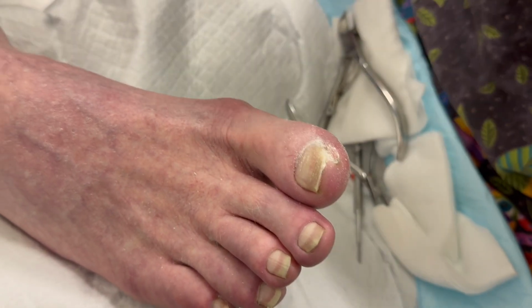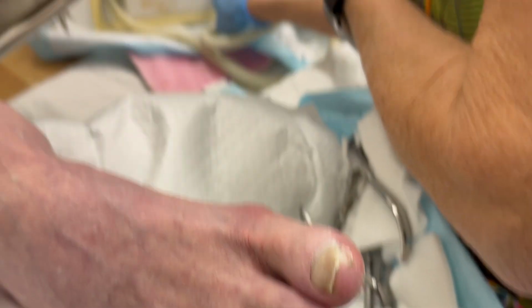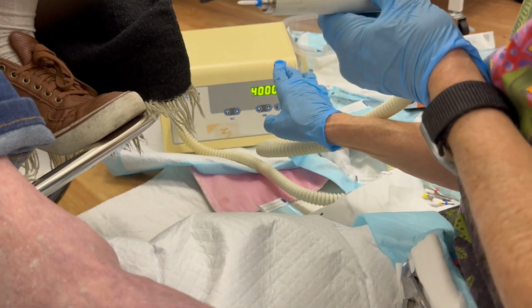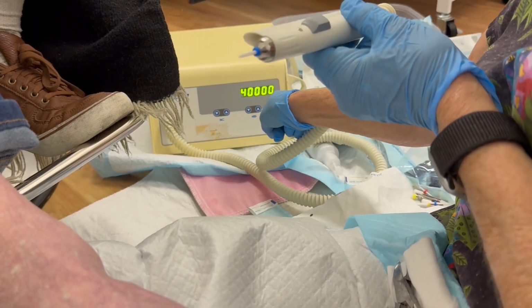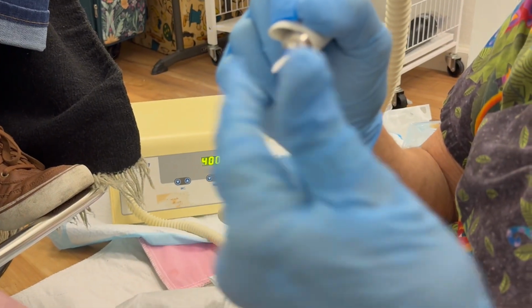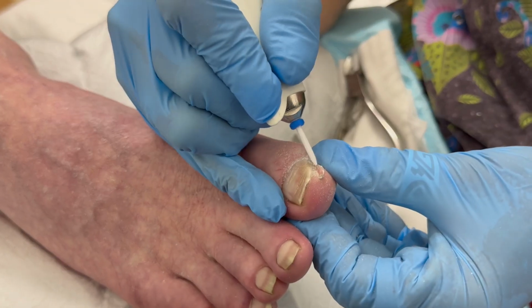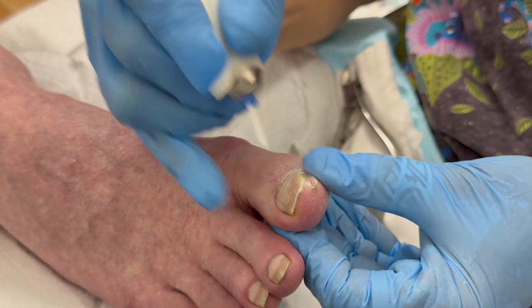Okay, so we're going to go for the medium pointy. And I am going to try to see if I can go in reverse though. Let's see if the light, it's been so many years. The green light is on. Let's see what direction. It's either going forward or backward, and it's too fast, so I'll be able to tell once I get it on here. Oh, it's going backwards. Okay, so this is what I want.